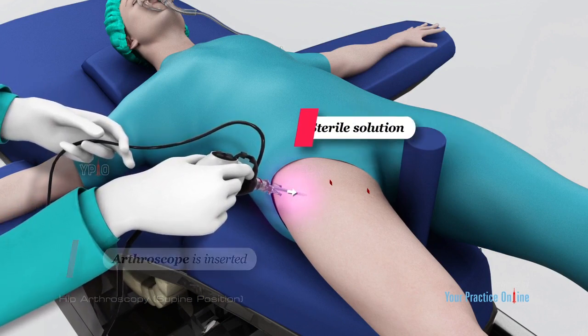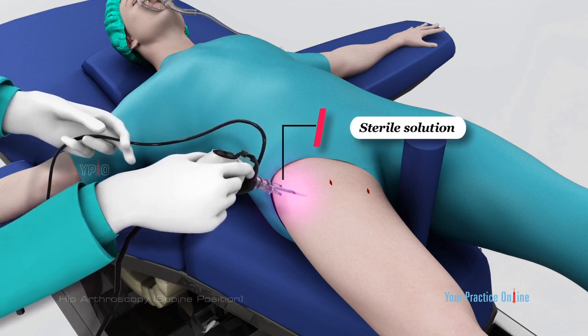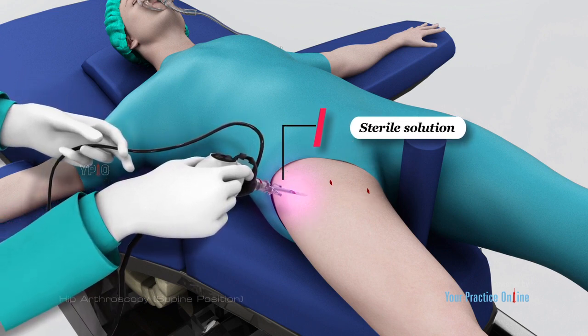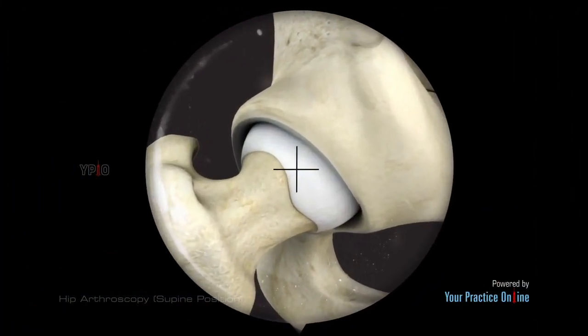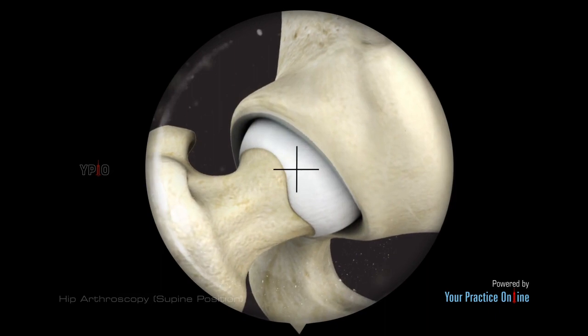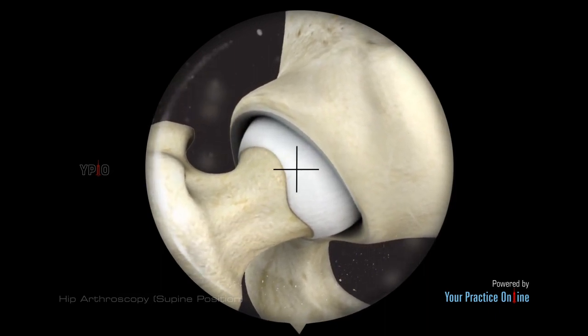Along with it, a sterile solution is pumped into the joint to expand the joint area and create room for the surgeon to work. Enlarged images on the television monitor allow your surgeon to visualize the joint clearly and determine the extent of damage so that it can be surgically treated.